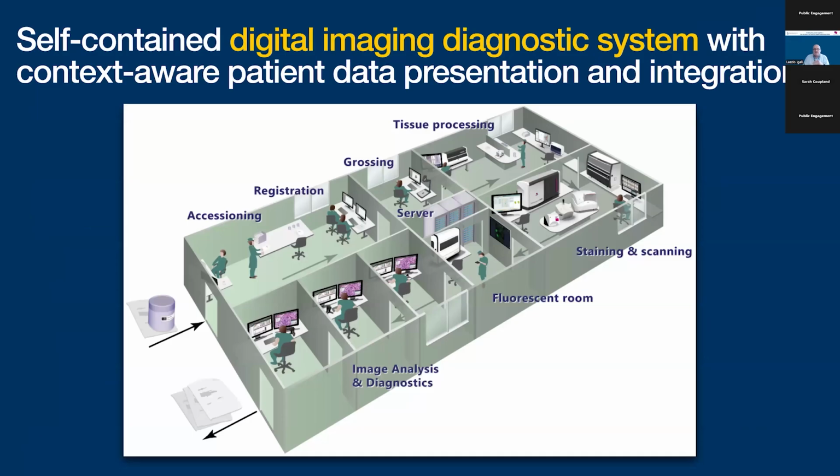Going back to the next step, the self-contained digital imaging diagnostic system, with context-aware patient data presentation and integration. It is a mouthful, but I hope every word has some meaning in this sentence. Yes, we need to have the IMS, but the best IMSs give you patient data at the same time. It could be just as simple as your request form, up to the précis of the digital imaging from radiology or other areas from your patient administration system, like clinical letters. These all save your time in accessing clinical information.